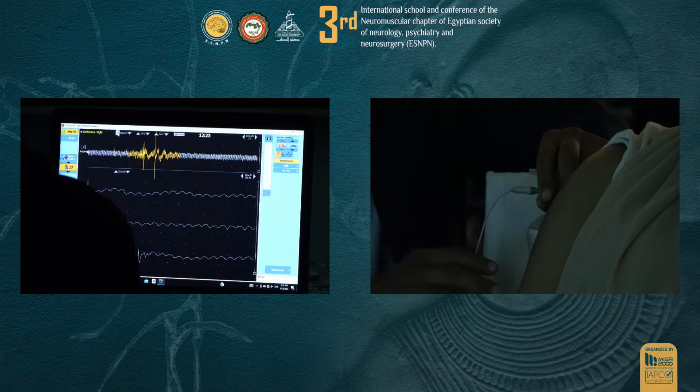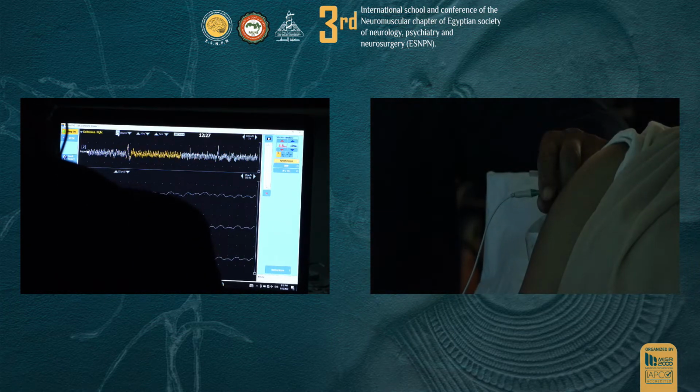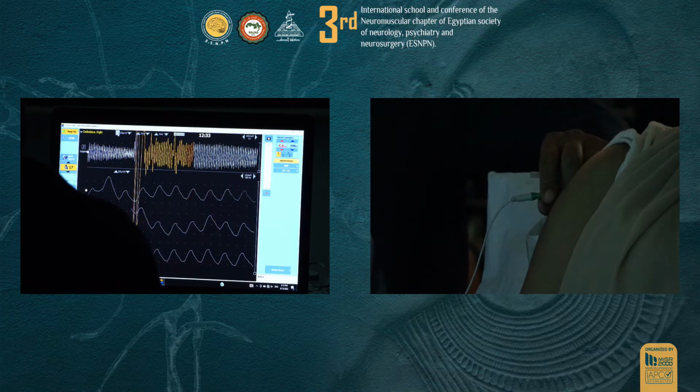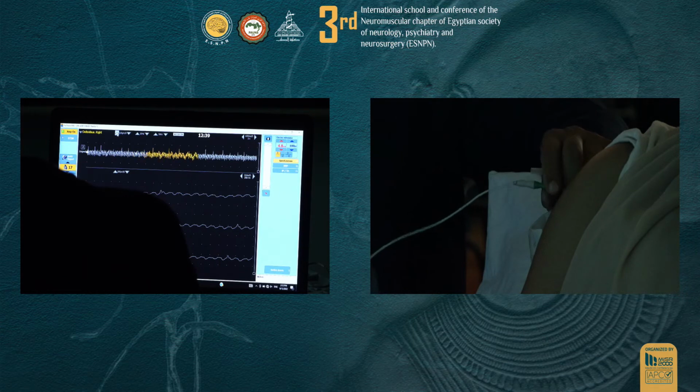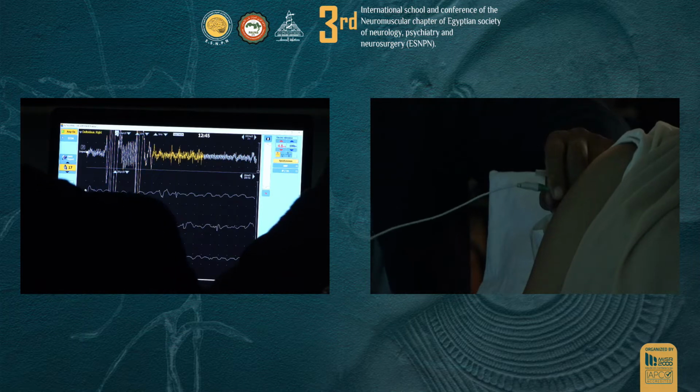Is it working? Something is working, but it's not that good, but at least we can. So what's the 100 microvolts? Yeah, this is definitely, and you can see changes, but anyway, I'll see what we can do. Okay, hold this wire over here, please.